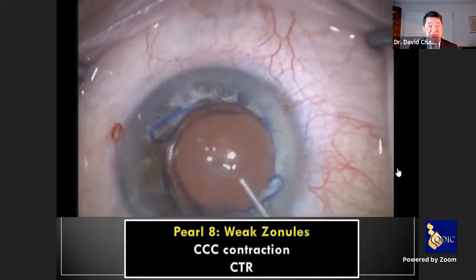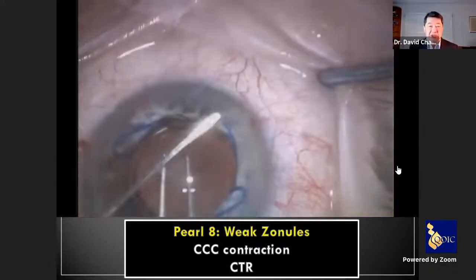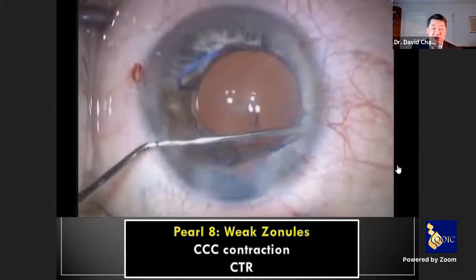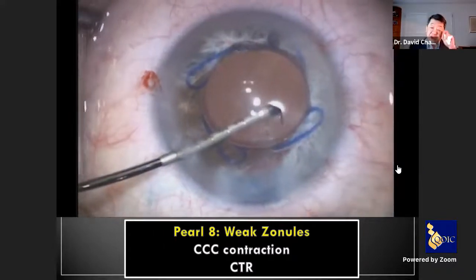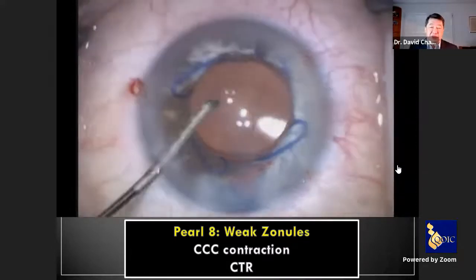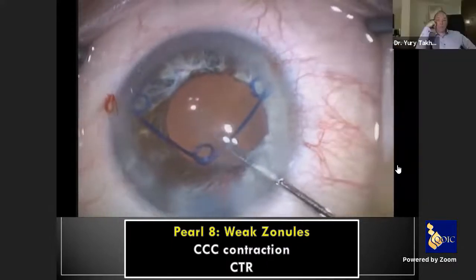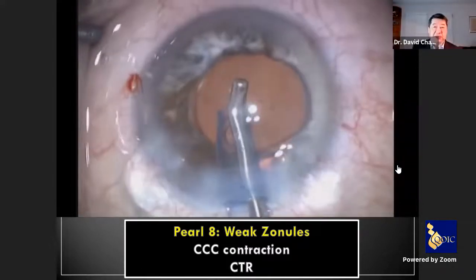with the CTR. And you don't have to be quite as compulsive as me, but I like to make the rexis diameter a little bit larger, because it will contract with weak zonules, even with the CTR. And you can see that with the Malyugin ring, I can expose this area without just making the pupil wider. I'm actually moving the pupil. And now when I remove this, let's look at the iris stroma, and you can see how this is sort of the most gentle way, I think, to open things up.